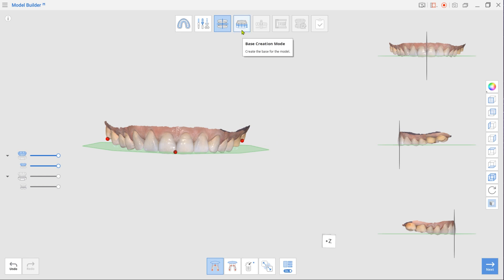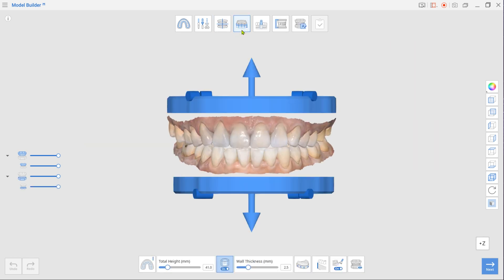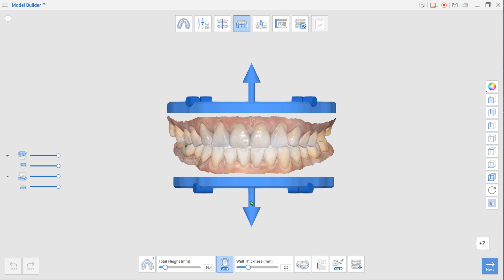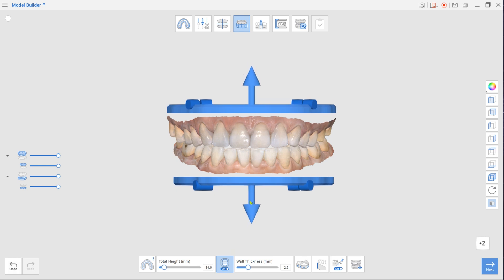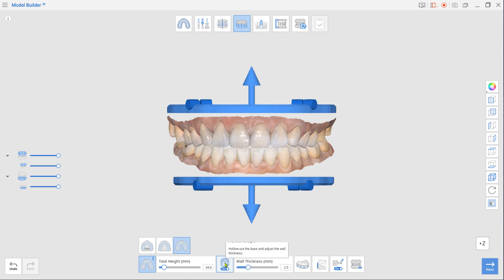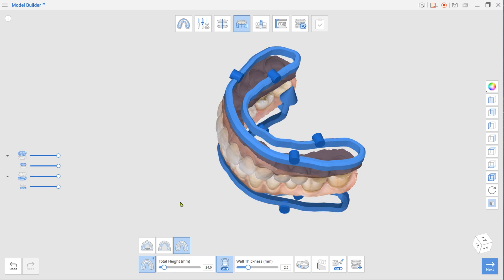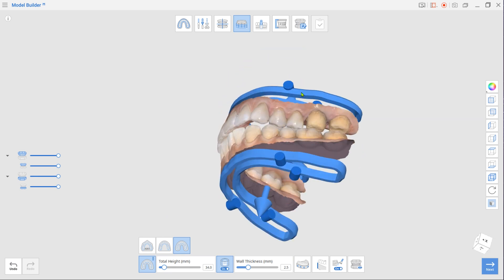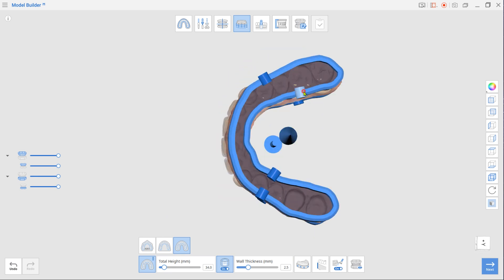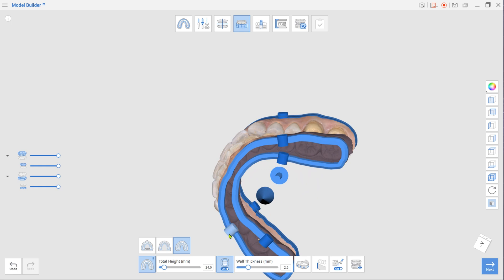Next is Base Creation mode. Drag arrows up or down to adjust the base height, and select Plateless Model as the base type in the toolbox. To minimize consumption of resin material during printing, leave the Hollow Shape option on. Create Drain Holes and ensure they are not placed near your working dies. Adding drain holes will prevent blowouts caused by cupping.